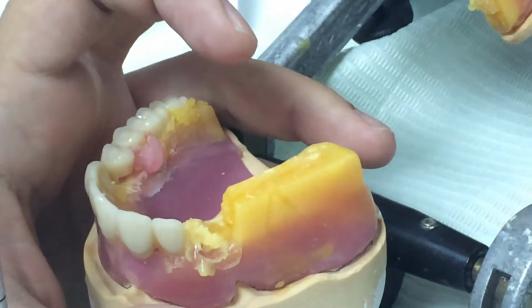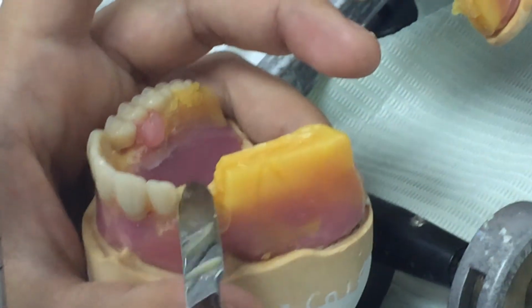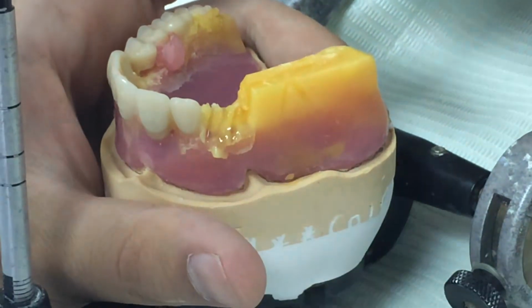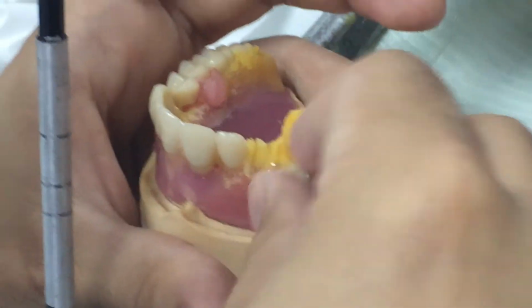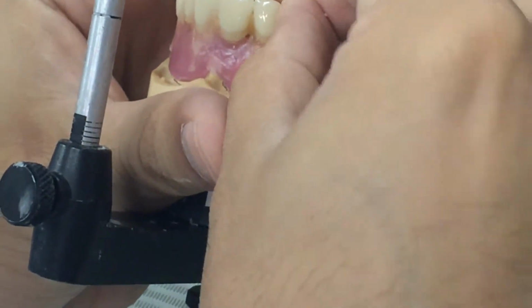طبعا راح نرجع على الجايد لاينز, لكن if we have let's say a play area which is not enough for the tooth, means there is not enough space for the tooth, what we're gonna do?